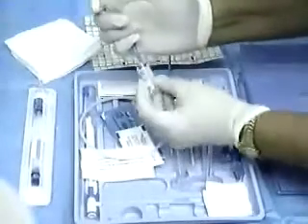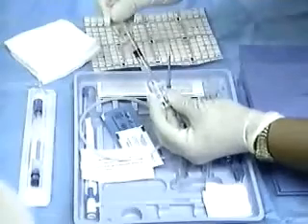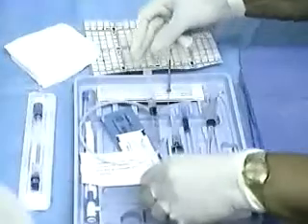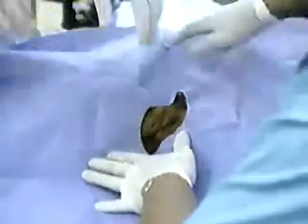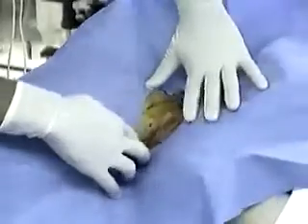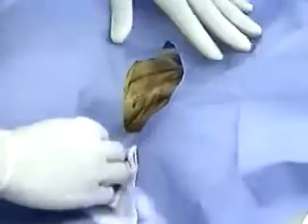Fill the syringe with lidocaine. After the betadine has dried, apply the sterile drape with the opening over the insertion point. Place sterile gauze adjacent to the opening in order to wipe up any blood from the needle stick.